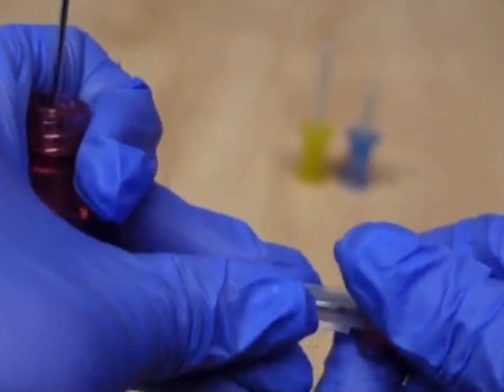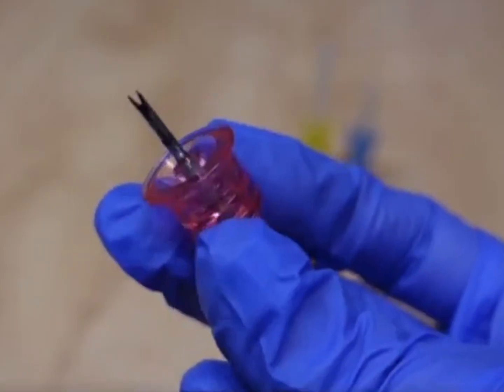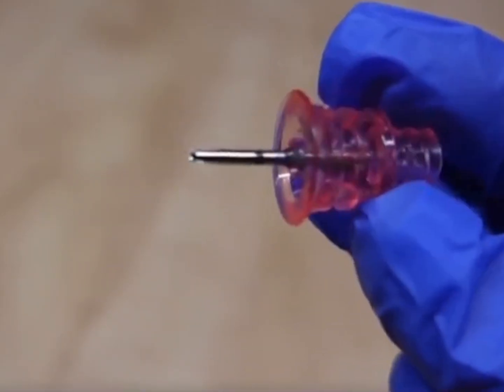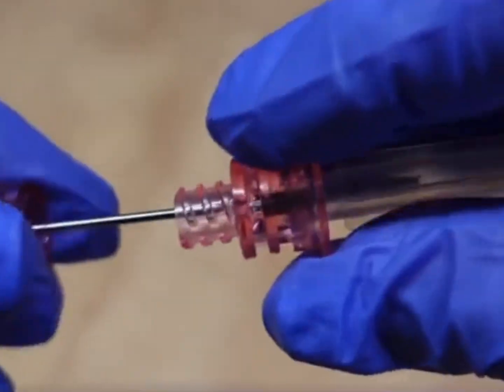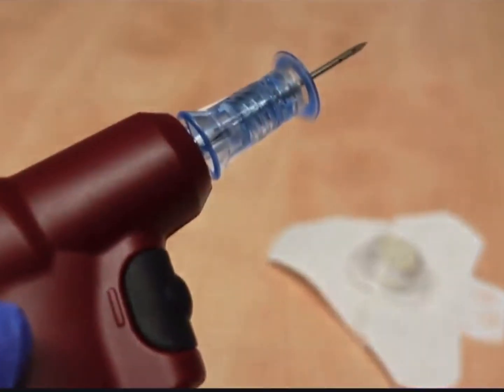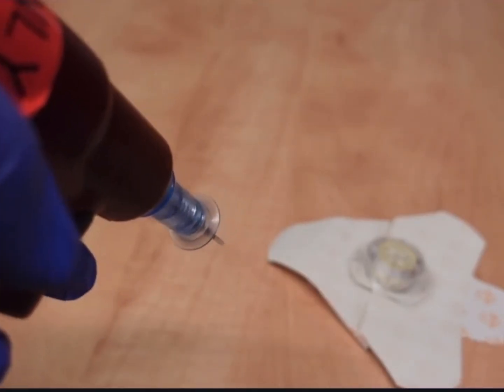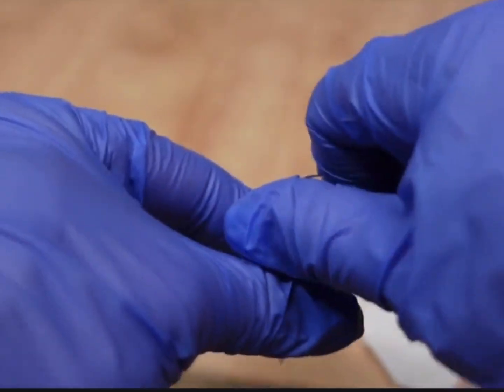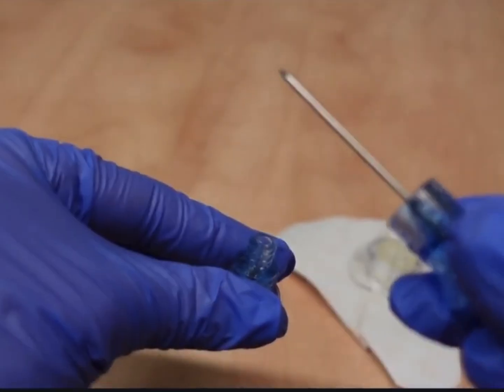So that stylet is in the left hand there. It's the long piece. This is the catheter that's going to go into the bone, and you see the prongs that help grab onto that bone nicely. And then that hub is where you're going to have your extension set that it gets connected to. You would drill into the patient's bone, you would remove the drill, then you're going to remove the stylet, that long needle there, and then you see the hub.